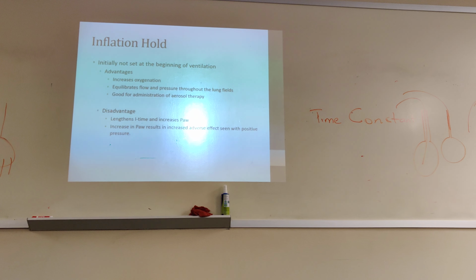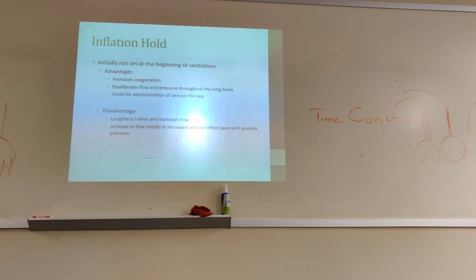But as you know, everything that has advantages will also have disadvantages. These are the reasons why sometimes therapists will tell you, "Well, we never use that. It's just there. We never use it. We don't even turn it on." No, it's not that. It's just that you have to know when to use it. If you institute the inflation hold time, it increases your mean airway pressure.